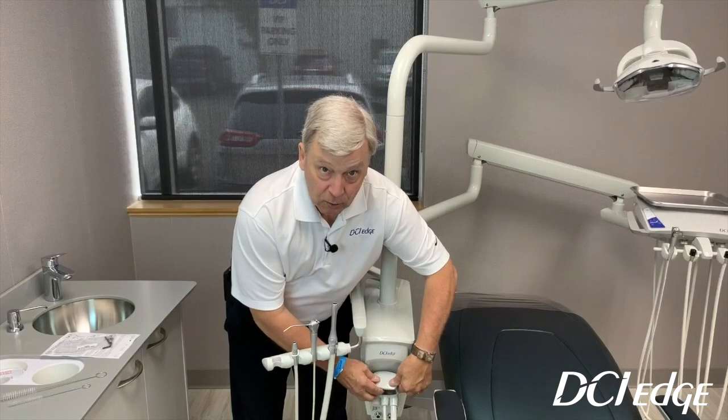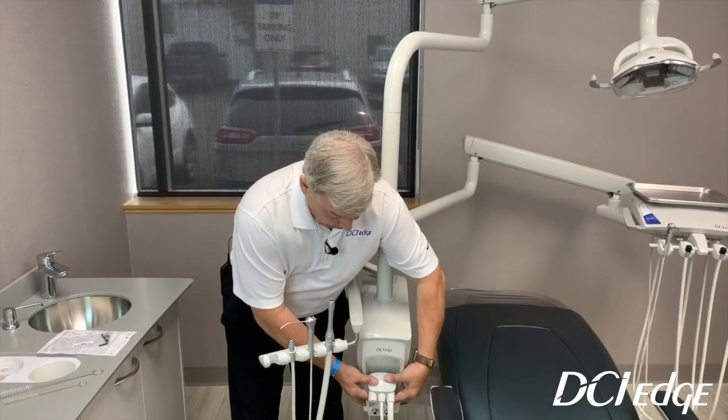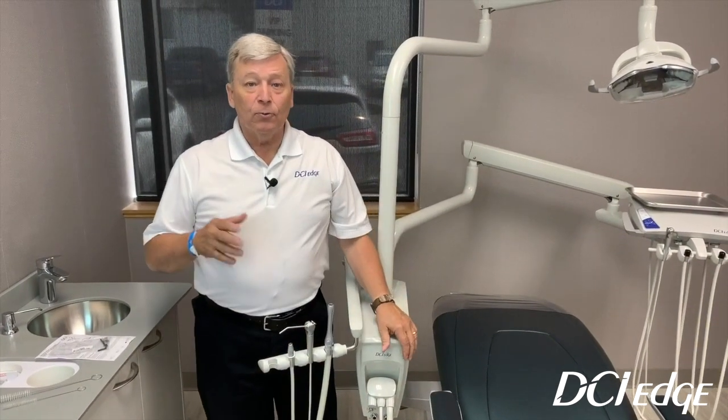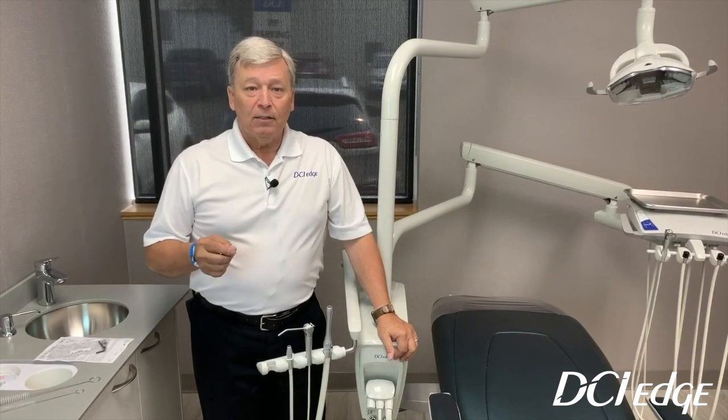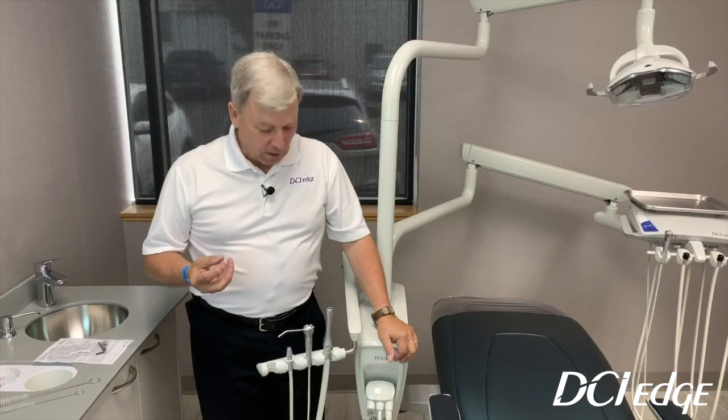I would suggest replacing the trap at least once a week at a minimum, preferably once every two to three days in a busy practice. That will prevent the saliva ejector and the HVE valve from losing suction power.